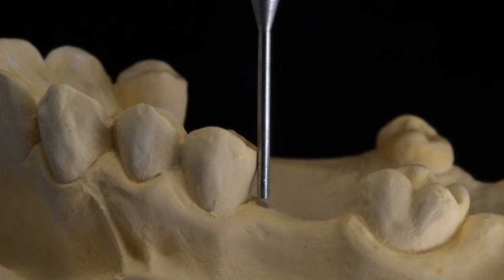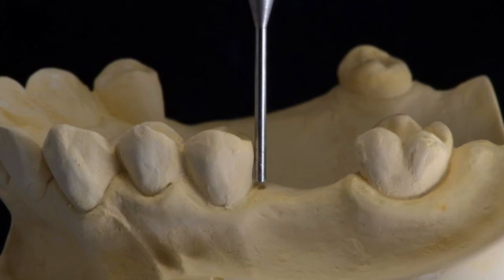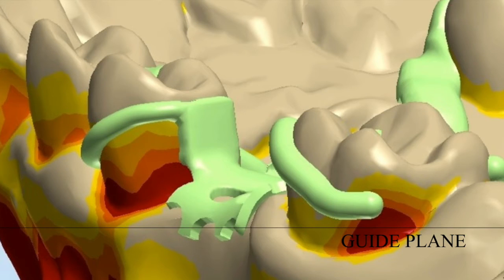This is a closer view when you're looking at the analyzing rod, looking at the anterior portion, and by making the occlusal plane parallel to the base, this amount from here to here is a more favorable condition, and that will be the anterior posterior tilt. And this area that we just looked at in the proximal surface will be the location of our guide plane, which is a component of the metal framework, where it will be placed and positioned.